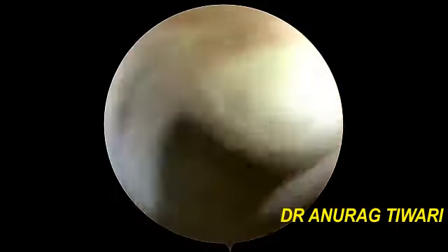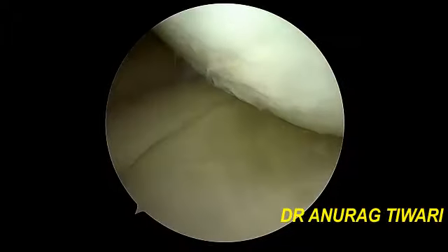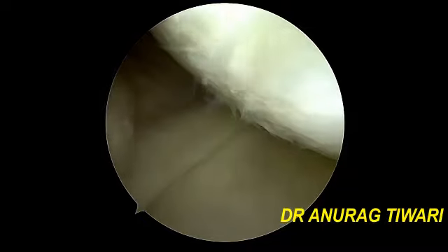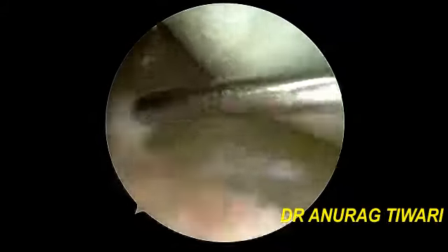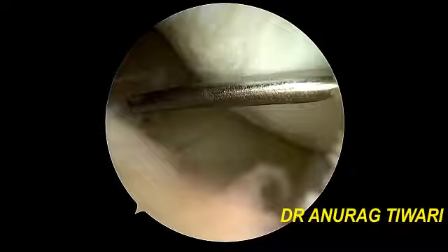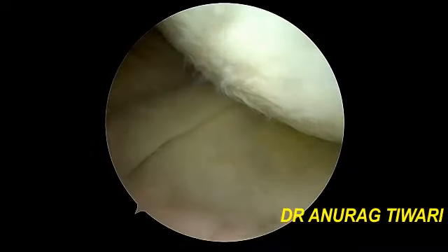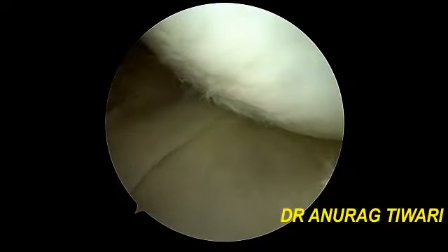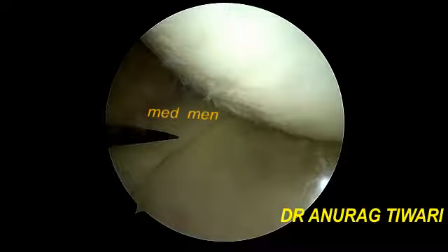So I made the anterolateral portal, the standard anterolateral portal just lateral to the patellar tendon, and I have done the diagnostic scopy. Now I am making the anteromedial portal. So for the anteromedial portal, this needle should be inserted just above the medial meniscus and in front of the medial femoral condyle. After this, you will just insert the knife through the needle tract.